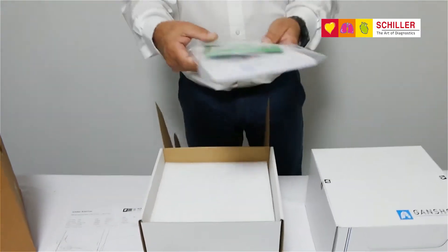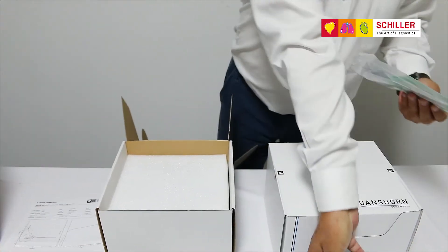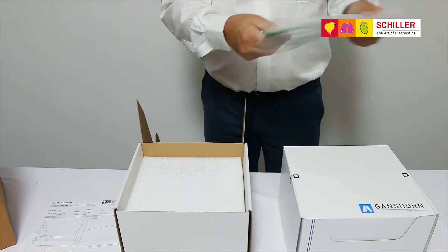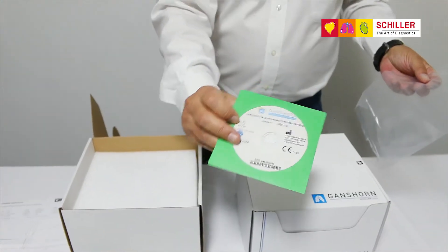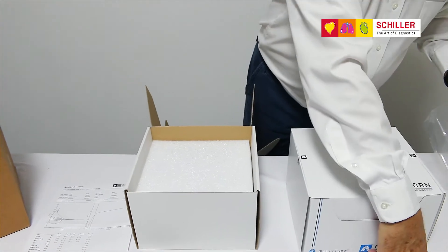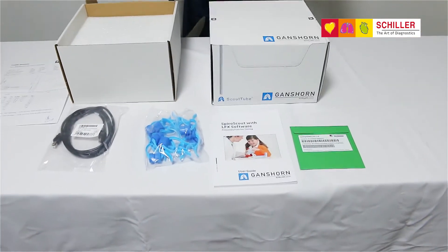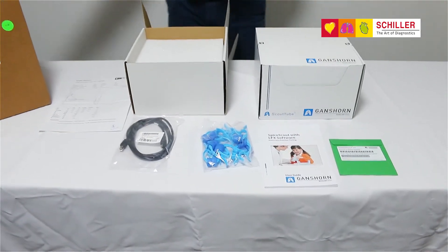A pack containing the user manual and the CD-ROM with the LFX software, and most importantly the product key, which you will need for your installation.